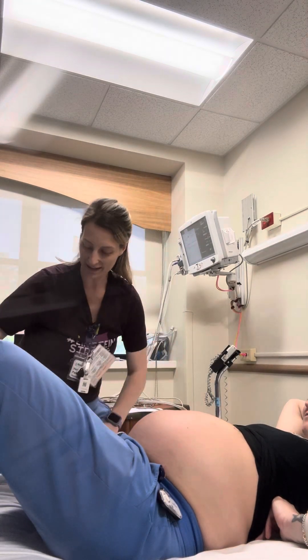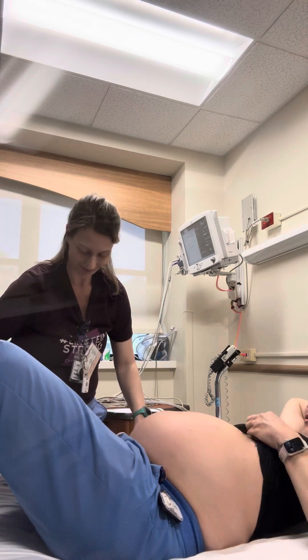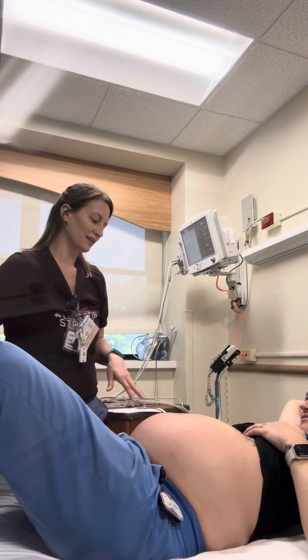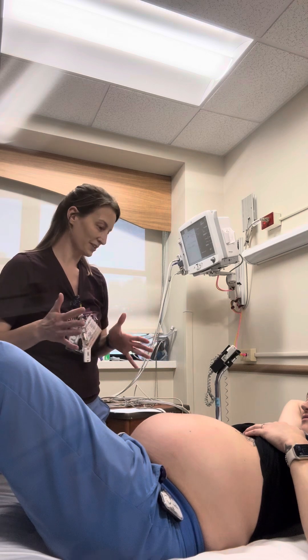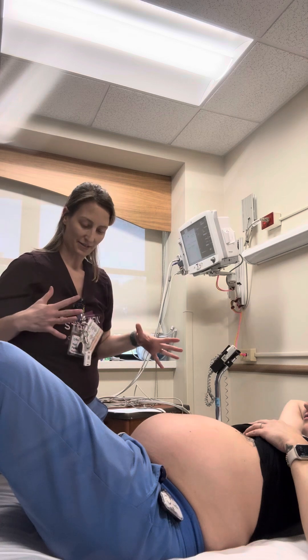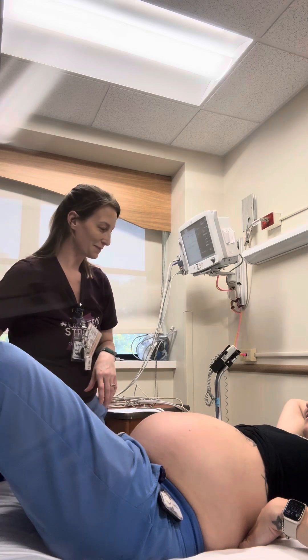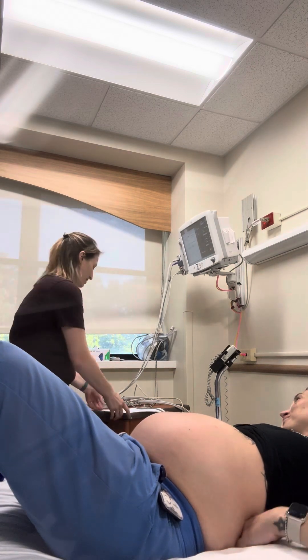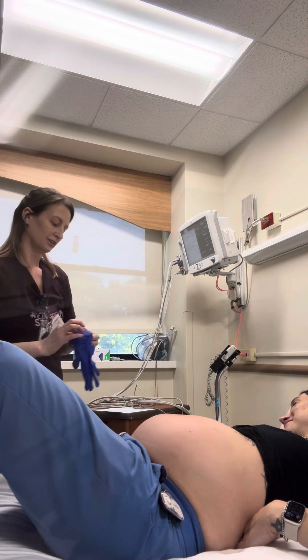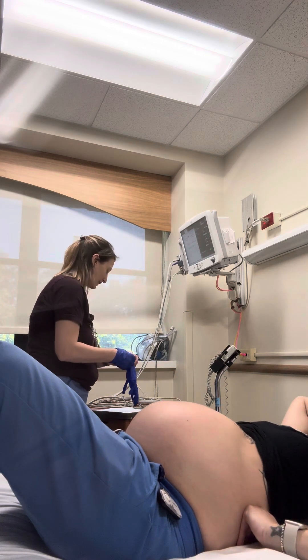I have my pregnant client here today for a visit. How far along are you? 35 weeks, wonderful. We're going to do some Leopold maneuvers to see what position your baby is in, the flexion of their head, confirm that, then measure baby and do fetal heart tones. Are you okay with me starting this assessment? I'm going to wash my hands, so just relax your abdomen muscles as much as possible, and keep your legs flexed — that's perfect.